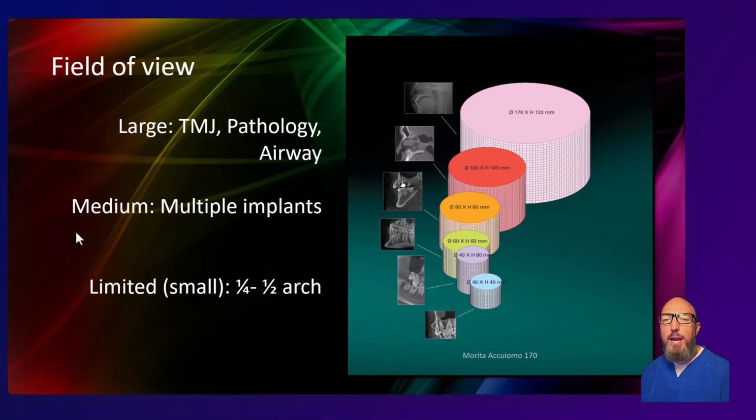And so here's the practical mindset. If you're considering CBCT for implant planning and your machine does a focused single implant scan at 20 microsieverts, that's probably the low dose setting, then go ahead and use that one. That's the equivalent of about 4 intraoral radiographs or maybe 1 panoramic radiograph. For information that could prevent you from injuring the inferior canal or perforating the sinus, I think that trade-off is a no-brainer. If you're considering CBCT, on the other hand, just to look around without a specific clinical question, well, then the dose is hard to justify. So that's kind of the guideline there.